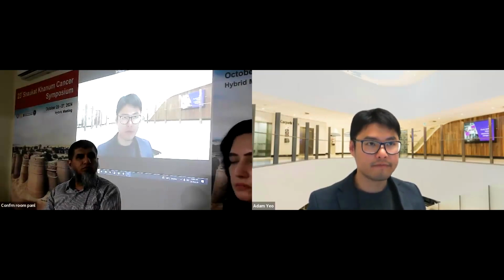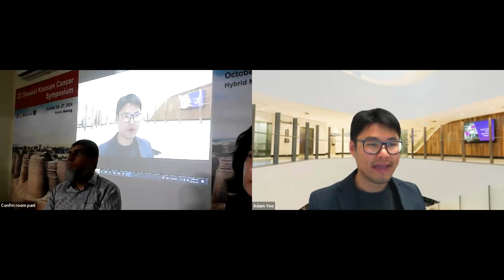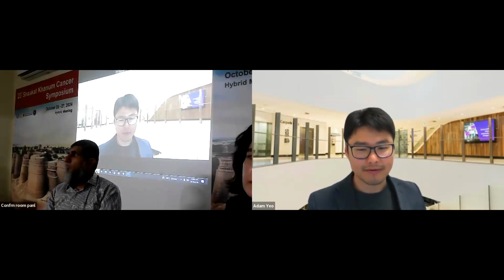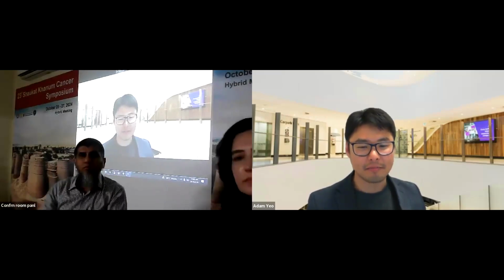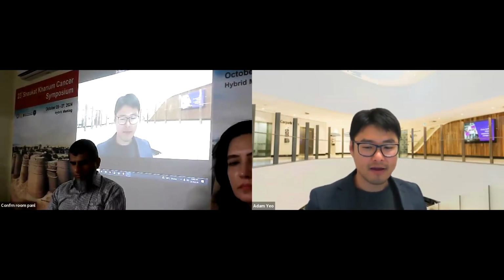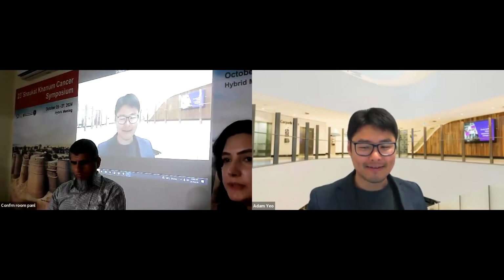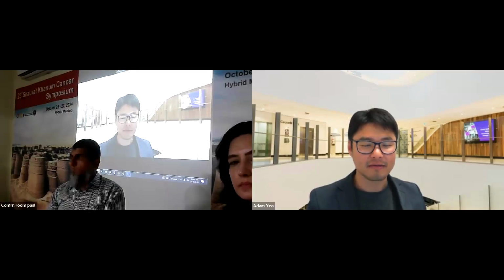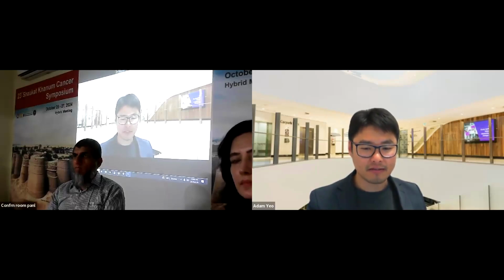When we do free breathing gating or breath hold, our first choice is around exhale, not inhale. There are two reasons. Exhale can be more efficient, with a better duty cycle, because most patients' breathing pattern has a longer exhale when they breathe out, and inhale is a sharp peak, so there's not much time to beam on. I'm sorry if you misunderstood; I did say exhale. We do exhale. Yeah, that's a really important tip. The more important reason is that it's hitting the same spot when you breathe out, so in terms of consistency, exhale is more robust than inhale.